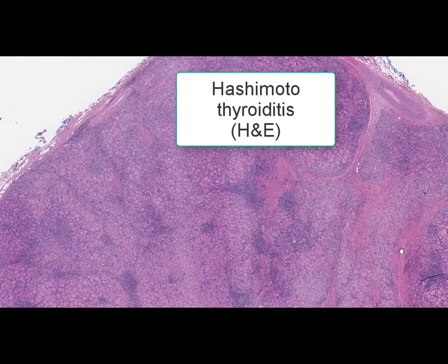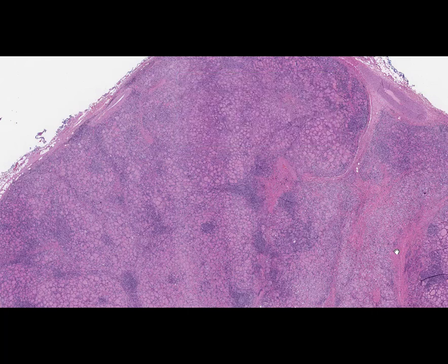On this slide again we can see a thyroid gland, stained by hematoxylin and eosin. The name of this slide is Hashimoto's thyroiditis. Same as Graves' disease, Hashimoto's thyroiditis is an autoimmune disease. However, in contrast to Graves' disease, it is accompanied by severe hypothyroidism and expressed typical morphological changes.